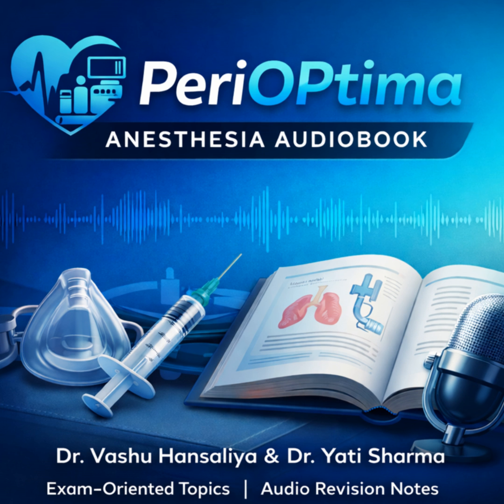So the key is to always link the system failure back to a measurable patient safety endpoint. Always. MGPS failure links to hypoxemia, measured by SpO2. Scavenging failure links to barotrauma, measured by plateau pressure. Always bring it back to the numbers.